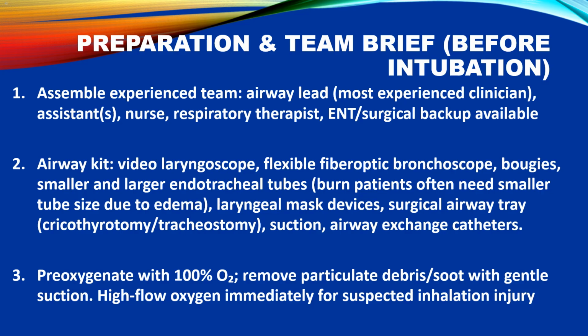3. Preoxygenation and preparation. Preoxygenate with 100% O2. Preoxygenate the patient with 100% oxygen to increase oxygen reserves. Gentle suction. Remove particulate debris and soot with gentle suction to clear the airway. High-flow oxygen. Provide high-flow oxygen immediately for suspected inhalation injury. Adequate preparation and team brief are crucial to ensuring a safe and successful intubation in patients with inhalation injury.